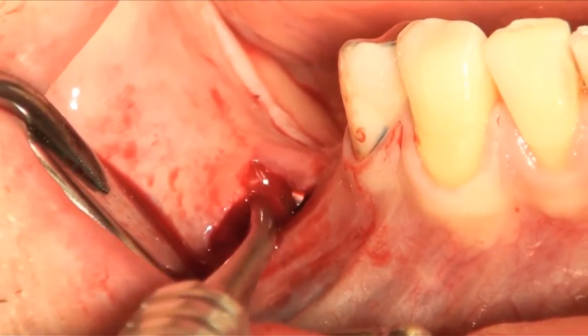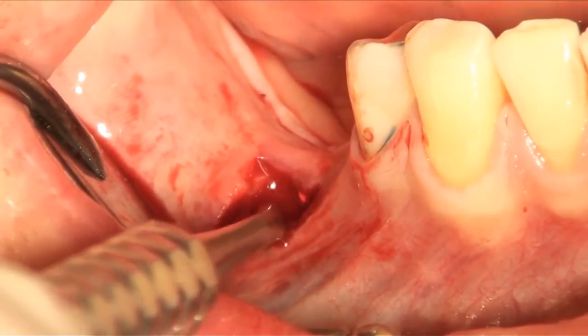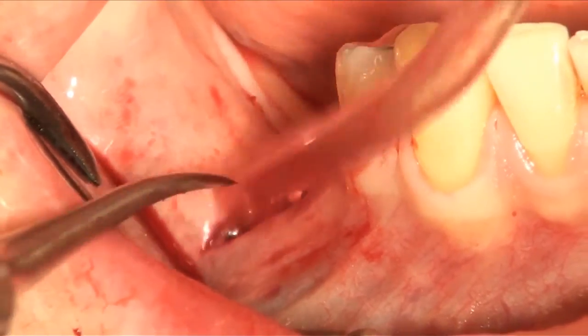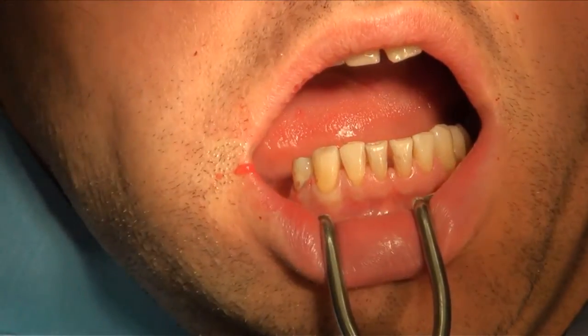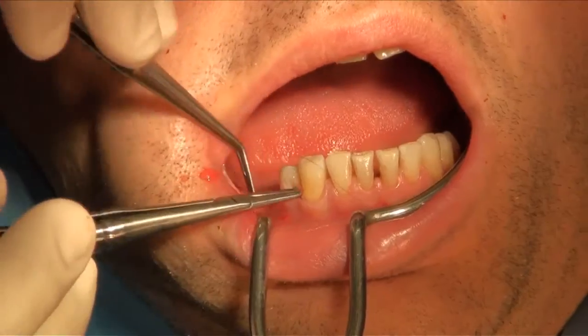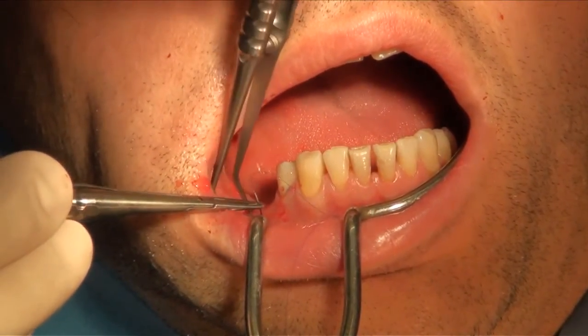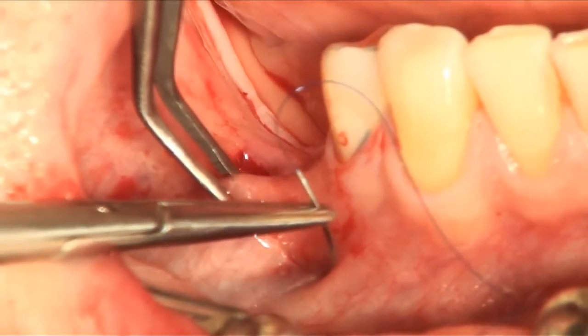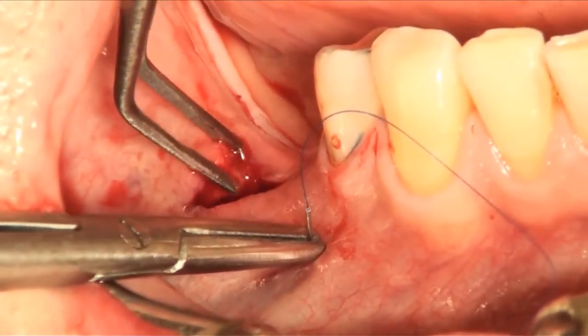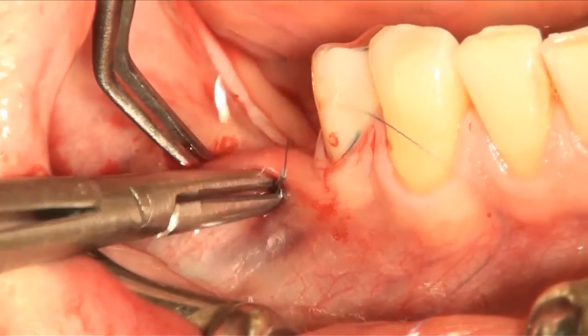The expander is placed and fits loosely into the pocket. And now we start a two-layered suturing. We start with a deep mattress suture for approximation of both flaps.